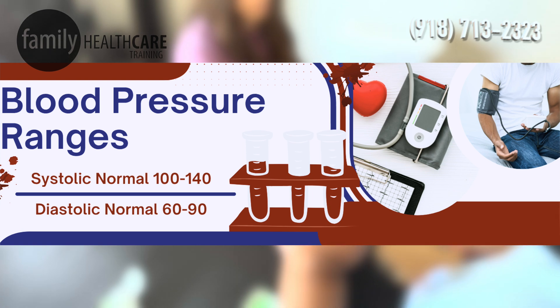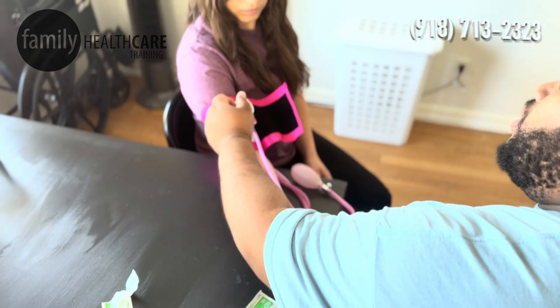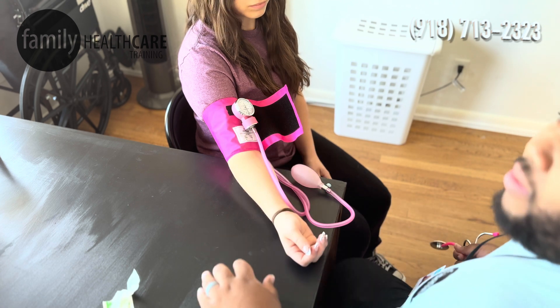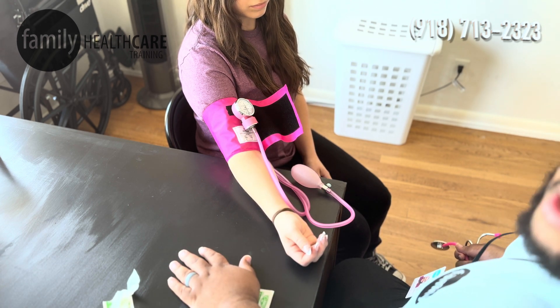Our diastolic pressure number is going to be the very last beat that we hear, followed by silence. For Miss Ashley, our systolic was 128 and our diastolic was about 62, which is within our normal limit for blood pressure.